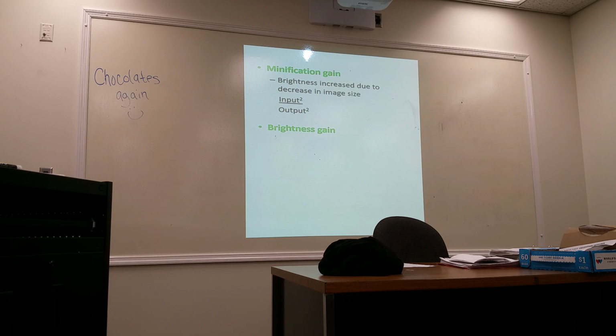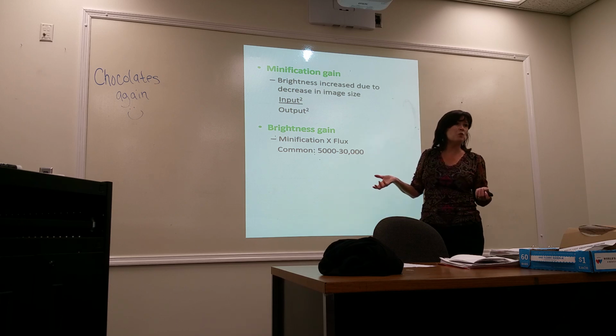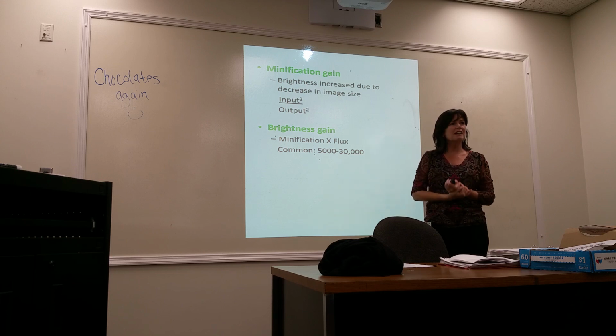And then if you take the flux gain and the minification gain together, then that is the overall brightness gain. So both of those things together. So basically the larger the number, the better the brightness. Now I've talked about this before, and I don't know if you'll remember, but none of that means anything unless you know what. I could try to sell you an II tube and go, oh, the overall brightness gain is 30,000. Wow, doesn't that sound great? Compared to 5,000, oh, you're like, oh yeah, I want that one. Boy, that'll be great. My staff will love it. But it may not be the best tube to buy unless you consider what.